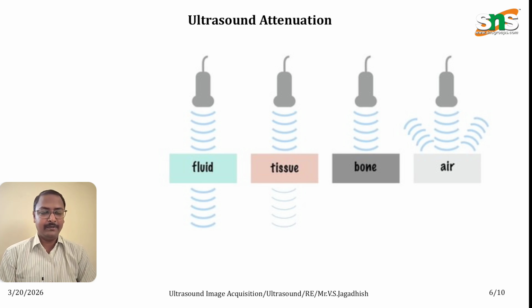I hope this video gave you a small idea about how ultrasound images form, what the principle behind it is, how these sound waves travel at different velocities in different media, and how that affects the image quality.